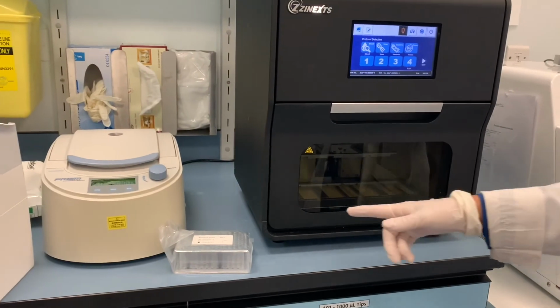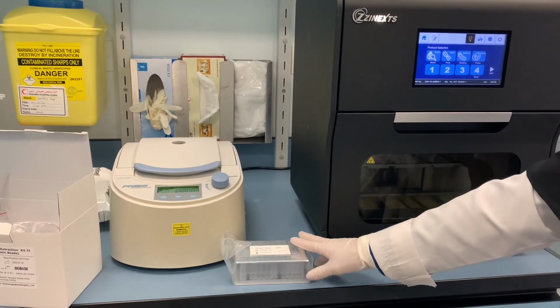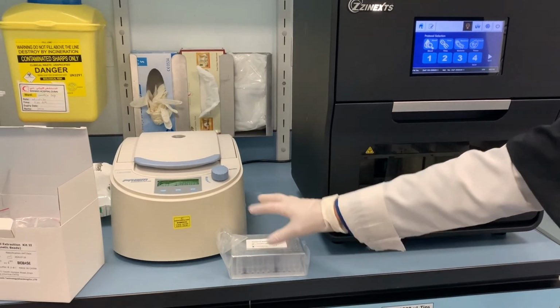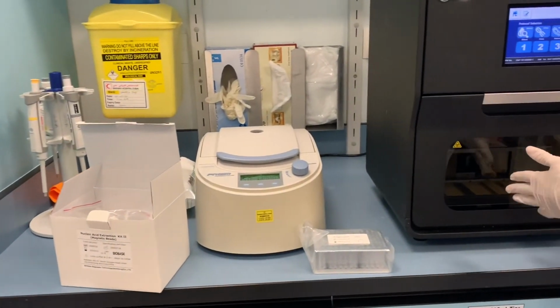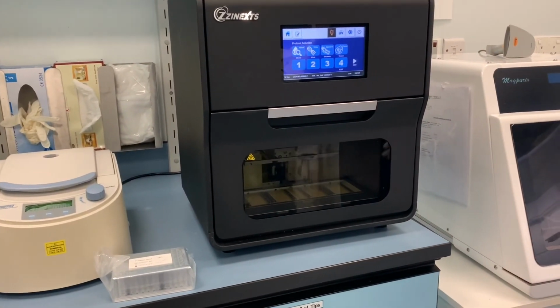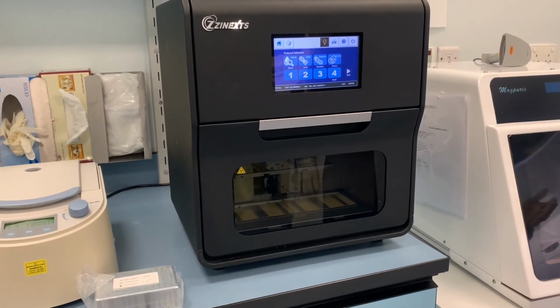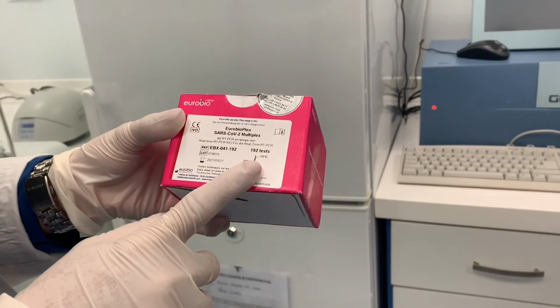However, in the black machine, the whole set of samples need to be placed, so about 32 samples need to be placed in there. And it takes about 30 minutes for the black machine to yield results and about an hour for the white machine. We will now move on to RT-PCR itself.